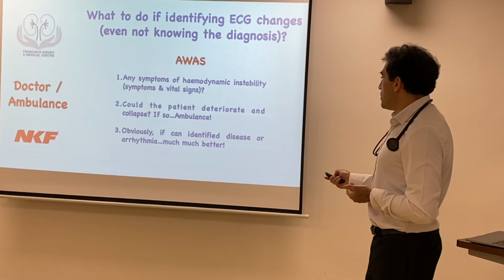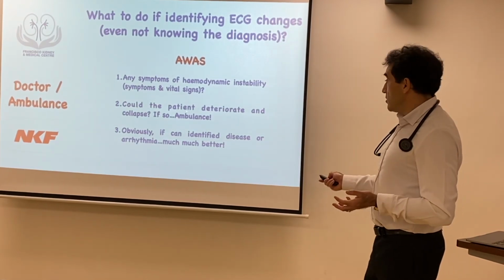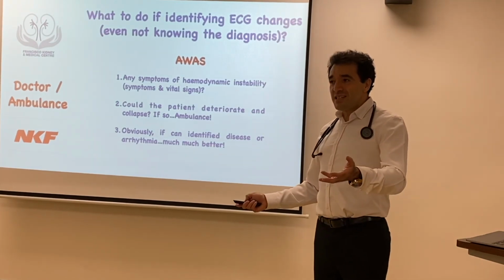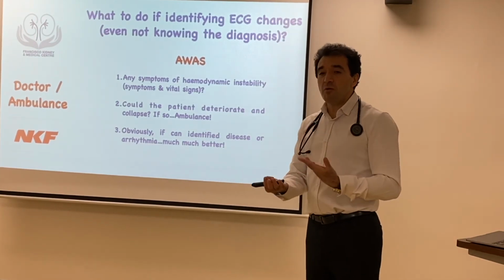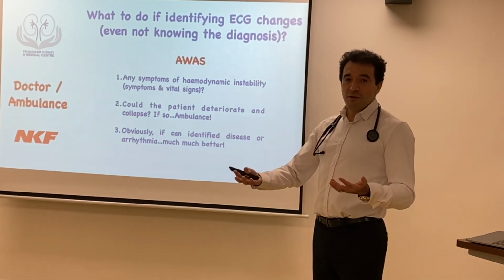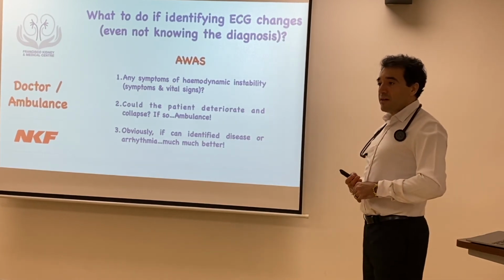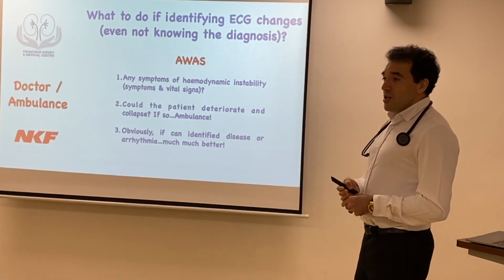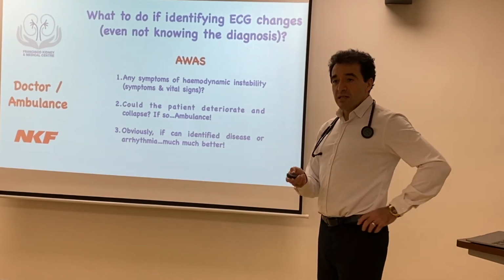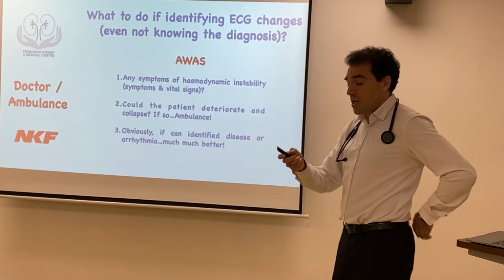And then the second important thing is that you need to know that the patient can deteriorate, no? So suddenly you find, oh, the patient feels funny, feels a little bit dizzy, and you identify some premature ventricular beats. So I think two things are bad, no? The ventricular beats can later lead to a worse ventricular tachycardia, fibrillation, etc. So it's probably the time to call an ambulance, especially if the patient is symptomatic, you have this, and if it's a new change.